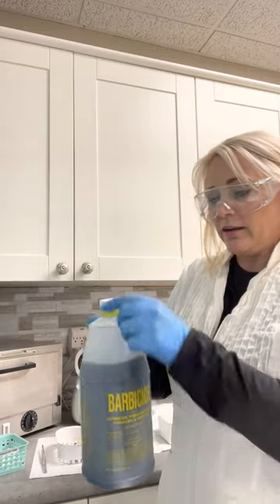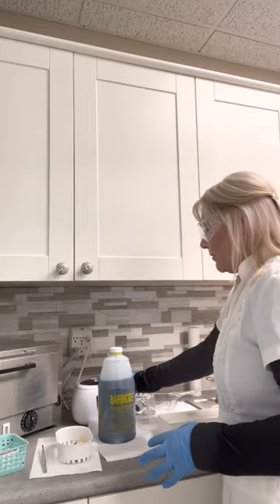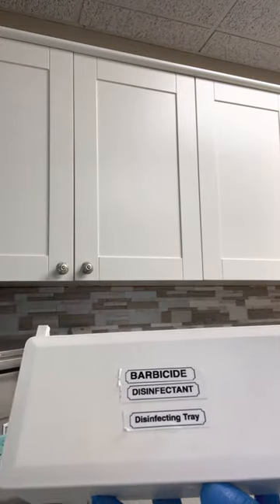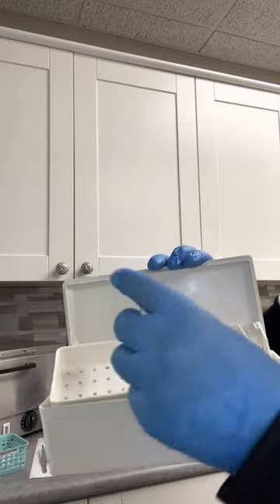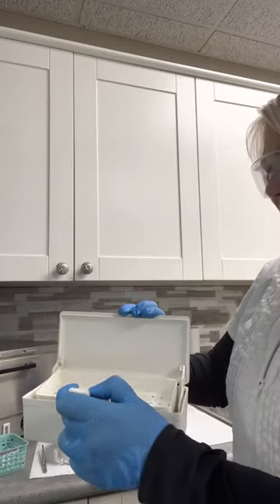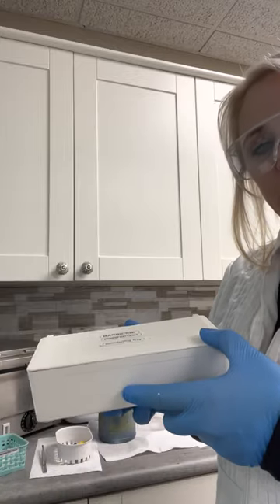Barbicide is a concentrate. It's a highly caustic product — you need to be very careful when you use it. I have all of my items ready for disinfection. I have a little Barbicide boat here, which says 'Barbicide disinfectant disinfecting tray.' You open it up and it has a little handle that flips out so that you could pick it up and take it out, and then you can fill the inside with water. It sits on the little ledges there. Fold it back in, close it back up, and it drops back down — a neat little disinfecting boat for a clinic room.